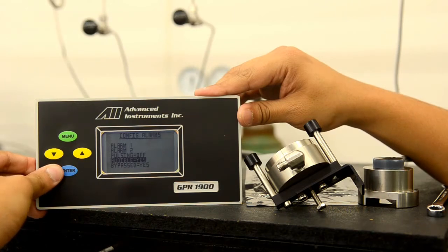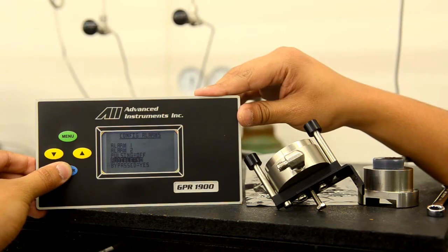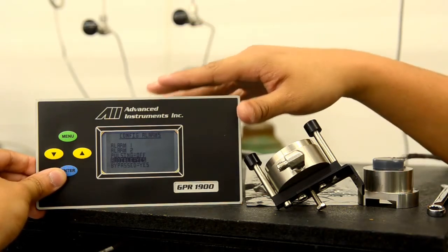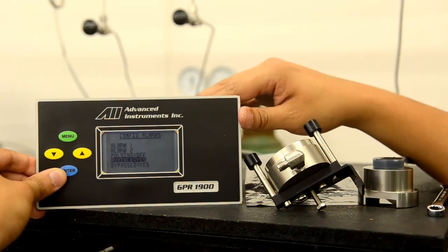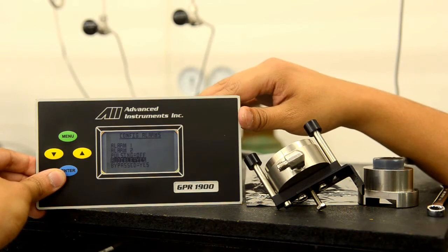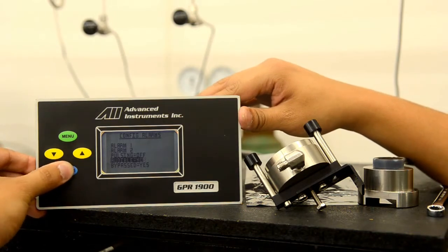We have an audible option, which is currently enabled. We can disable that again by hitting the enter button. The module itself comes with an internal speaker inside of it that will sound off when the alarm condition is met.